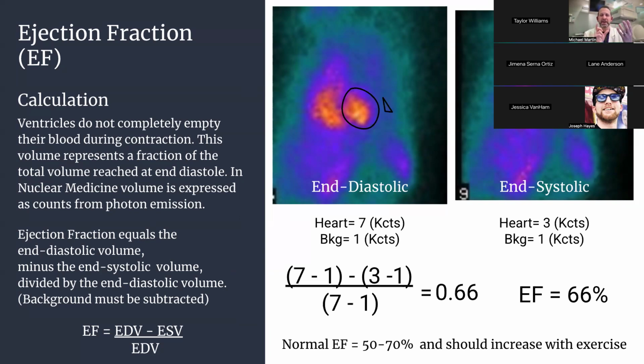We're doing something similar, but we're adding in one more thing, and that's frames, because each frame needs to be able to get up to a certain amount of counts. You can do both, but all three of those parameters are going to affect each other. In terms of answering your question more directly for a test, I don't think it's going to ask how many counts you should acquire on a MUGA scan. But it's the general idea of what you would acquire for other exams. On a MUGA, where you're getting several frames, I would say 250 is probably the lowest you should see. Most static images are 500, 600, 700 counts. They tend to go a little lower on MUGAs when we're trying to get all those frames, but I would say nothing less than that.